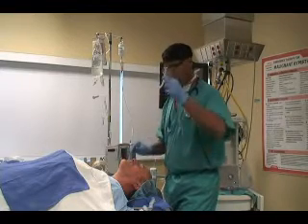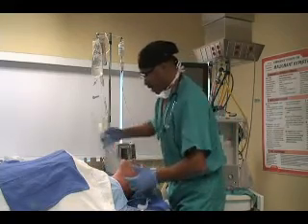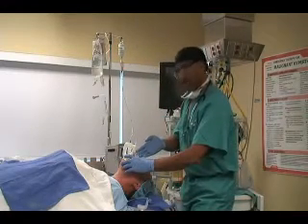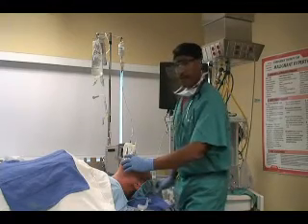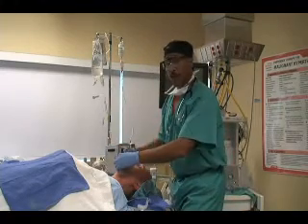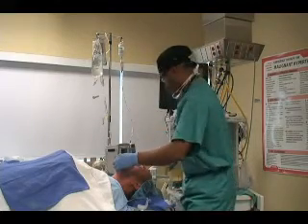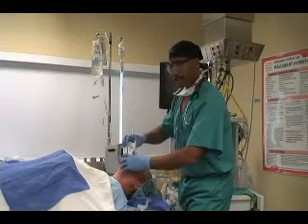Once that is done with a nasal airway or oral airway, I will check my ABCs, put my mask back in place, look for a rise and fall of the chest, look for condensation on my mask, feel the bag, and end-tidal CO2. If need be, if we have anything in the mouth, like blood or vomitus, I have my suction available here, and I can suck the patient's mouth out. Once that's done, reapply the mask and check ventilation.